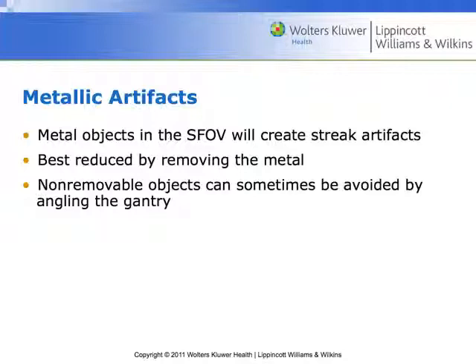You know, take off your crazy piercing that no one should ever see, right? Don't tell me it's hard to take off. You shouldn't have put it there to begin with, right? It's going to streak your pictures. If it's not removable, then we may need to angle the gantry, right? Y'all don't, I don't think in PET we have that option.